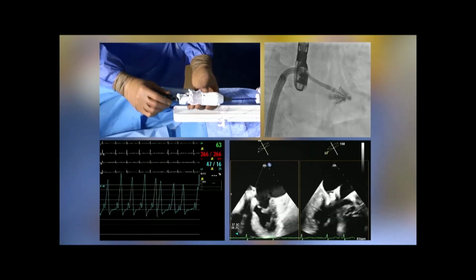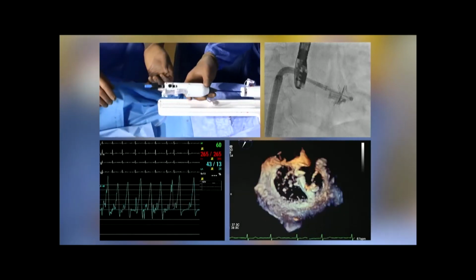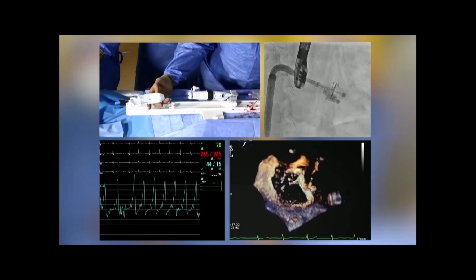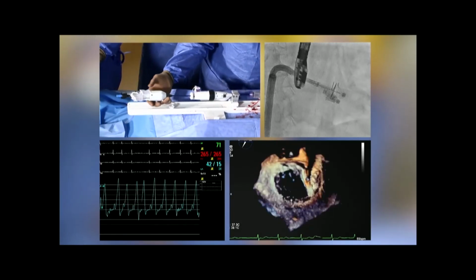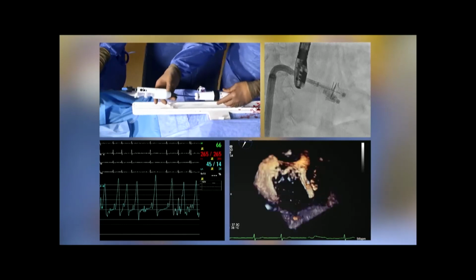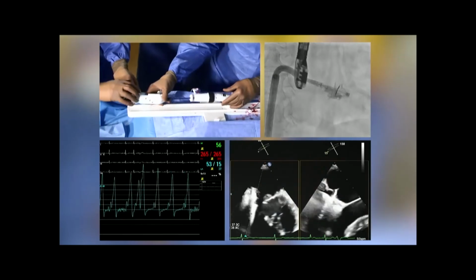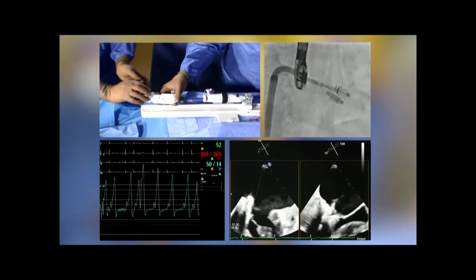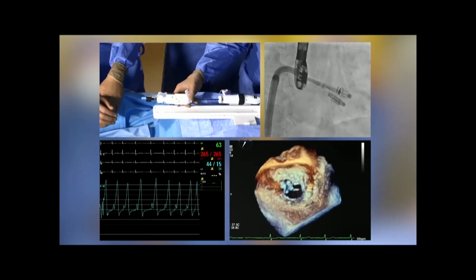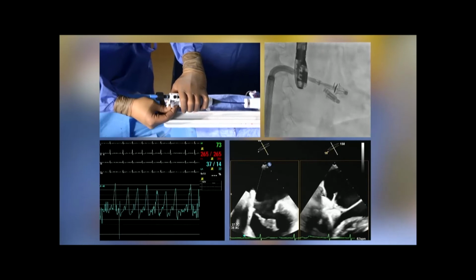Let's bring up the posterior leaflet, please. Posterior is up. I go more clockwise. I think we have to come more clockwise. We have to bring up the anterior as well. Otherwise it's difficult for me to turn. Now it's following, isn't it? Another 3D, please. So I turned to be more 12, 6 o'clock. Okay, good. We bring down posterior again.